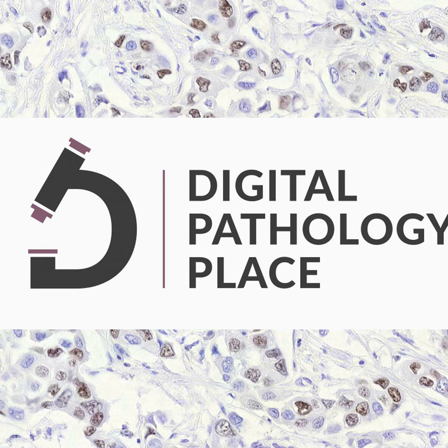EHRs typically contain a patient's entire health history, including previous diagnoses, treatments, and medications. By linking digital pathology systems to EHRs, pathologists gain immediate access to this crucial patient information, which can greatly aid in diagnosis and treatment planning. Moreover, digital pathology results can be swiftly transferred to the EHR, where they are immediately available for clinicians to make timely treatment decisions. In conclusion, the integration of digital pathology with LIS and EHRs enhances the holistic view of a patient's health, allows for more informed decisions, and ultimately leads to more efficient and effective patient care.